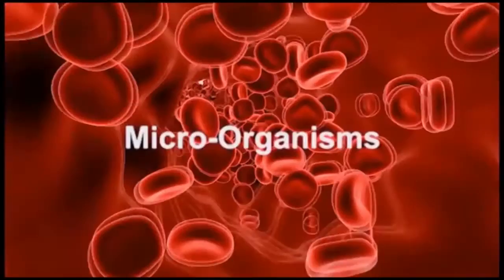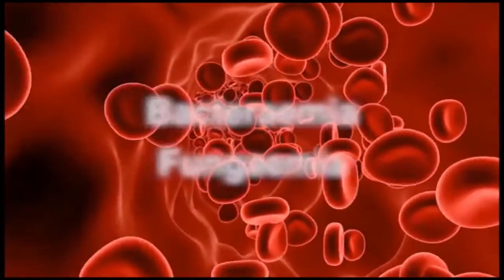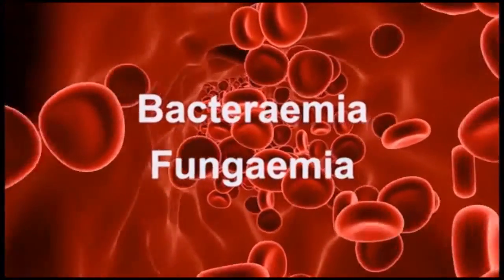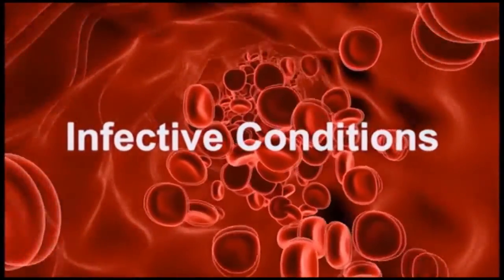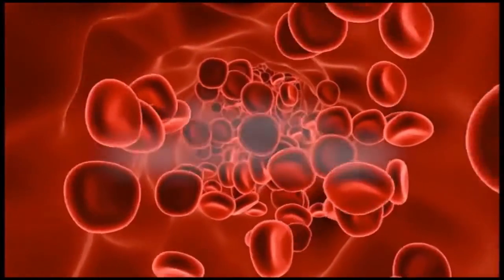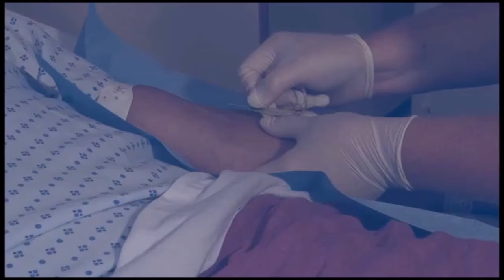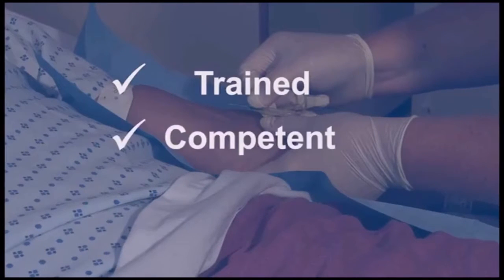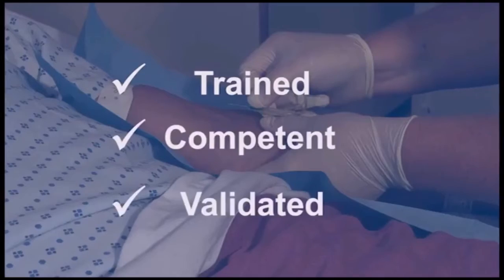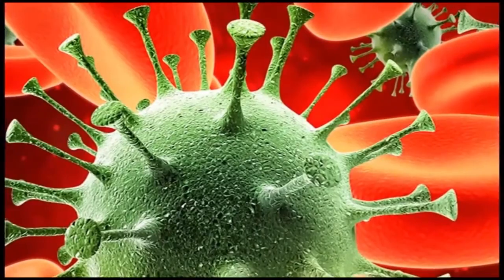The culture of microorganisms from blood is critical in the laboratory diagnosis of bloodstream infections in order to manage patients with many infective conditions associated with the clinical presentation of pyrexia. Blood culture plays an integral role in the evaluation of sepsis, and it is therefore essential that the blood culture procedure is carried out in a timely manner using an aseptic non-touch technique to avoid contamination of the specimen.